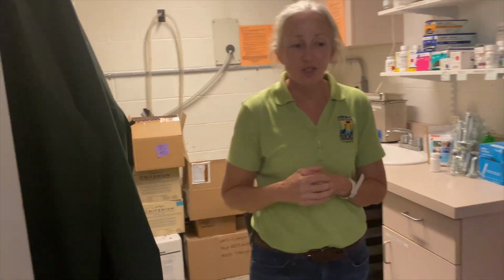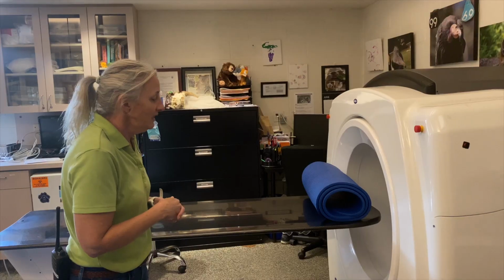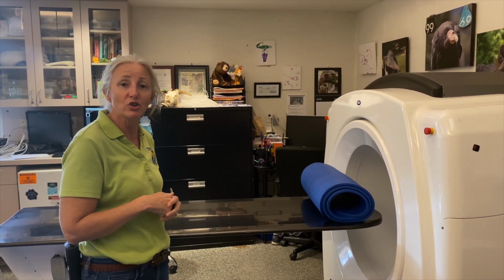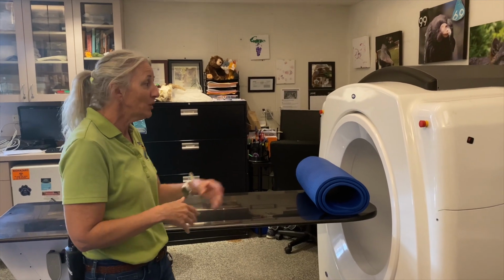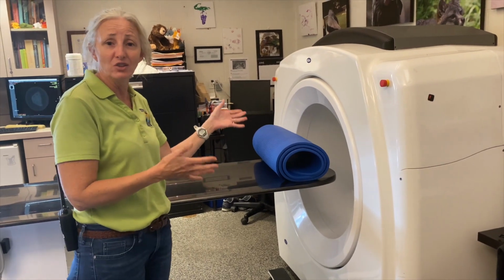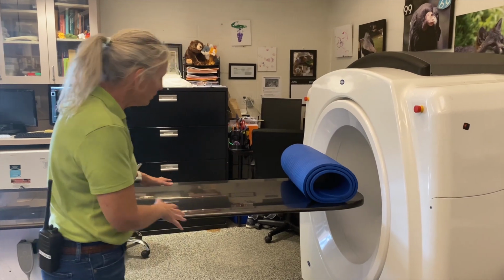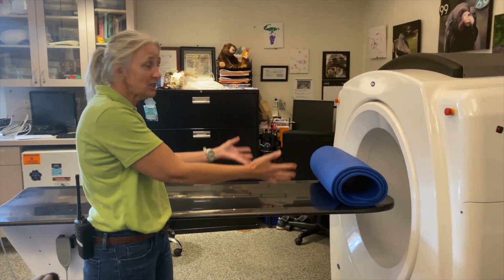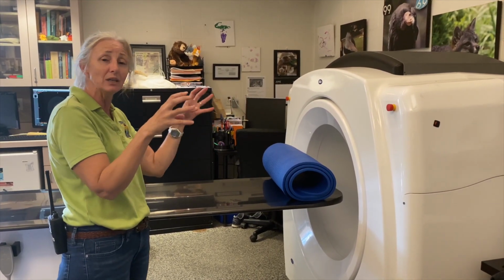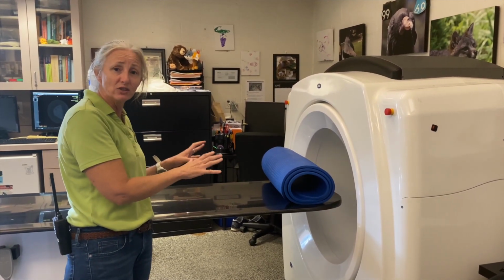And then coming back out into the hospital, we have another really cool piece of equipment that I want to show you that we acquired just last year. So we're really fortunate because a lot of veterinary hospitals do not have this equipment so far, and this was donated from a local company who makes these machines. We have our very own portable CT machine, which is amazing. It really helps our diagnostic capabilities, which means the tools that we use to find out what's wrong with animals. So they actually go on this table, they move into the CT drum, and then we get these images. It takes x-ray slices through the animal, and then those can be reconstructed to form a 3D image for us. So that gives us a lot of great diagnostic capacity.